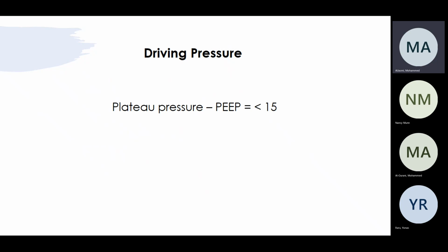So you would like to see if this PEEP is enough, or can I give more PEEP to recruit more? Yes. So higher PEEP will not improve mortality, is that right? No. It improves oxygenation. There's one study that showed maybe higher PEEP improves survival in ARDS patients, but we cannot answer the question that higher PEEP improves mortality, no. But it improves oxygenation. So I need to know if this PEEP is sufficient.